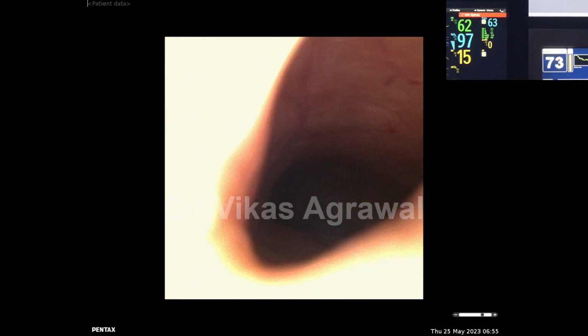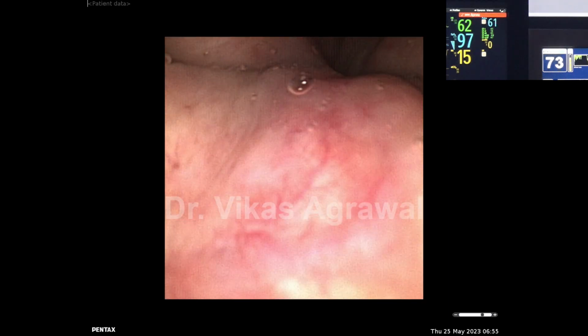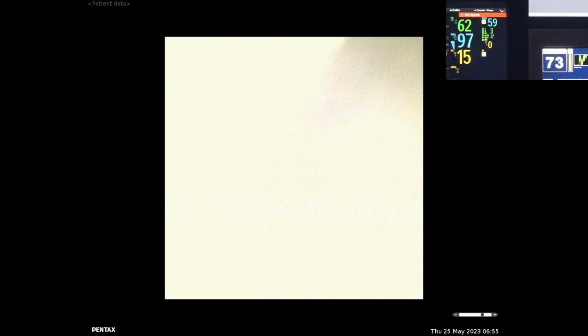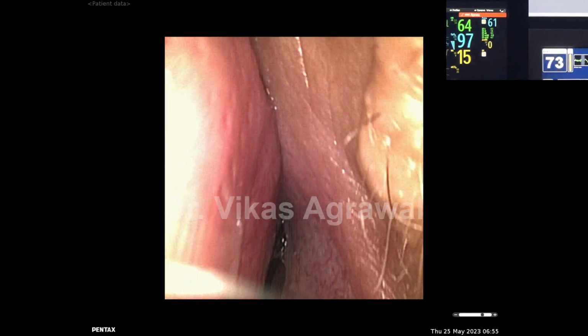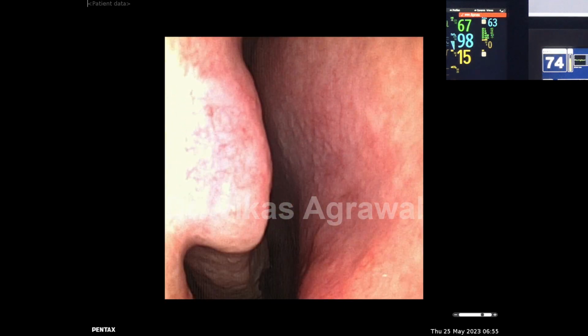So we understand that this patient has predominantly a palatal collapse, so he would require uvulopalatopharyngoplasty, suspension bridge, along with septoplasty for this high deviated septum, as you can see on the left, more on the cartilaginous part, and turbinate hypertrophy. So turbinates have to be shrunk.